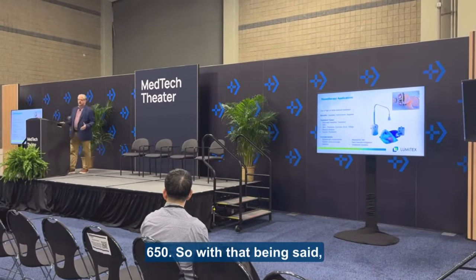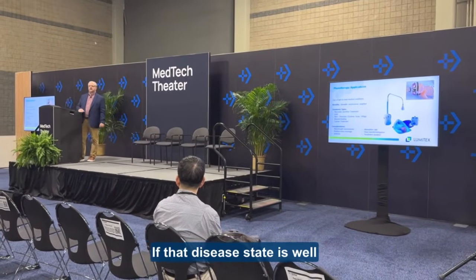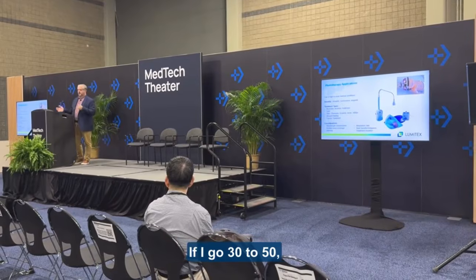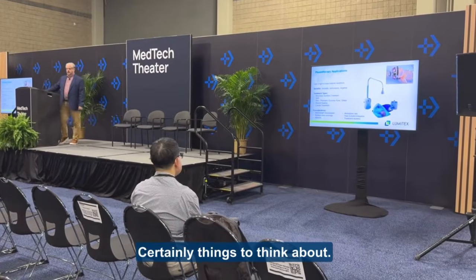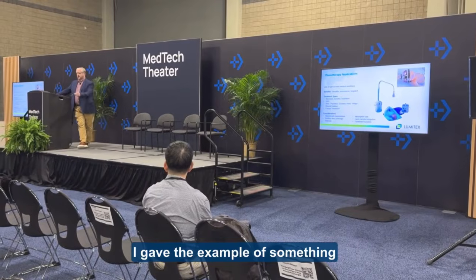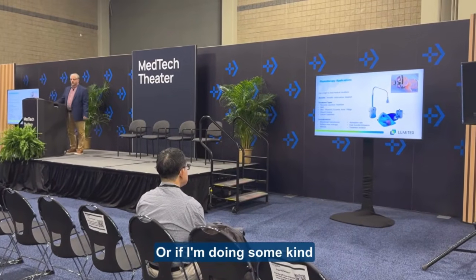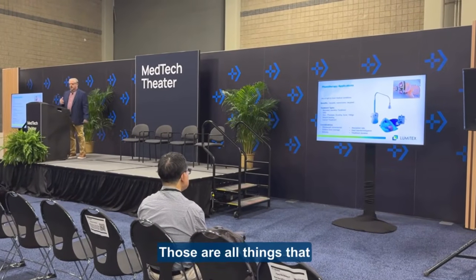So with that being said, what you need to consider is, are there any adverse effects? If that disease state is well treated within that narrow wavelength, what are the ramifications if I go plus or minus that? 30 to 50, are there any adverse effects? Do I have to have the treatment go longer? Certainly things to think about. Surface area coverage is another good one. I gave the example of something like vitiligo. You may need to treat the whole body and put them in some kind of booth, like a tanning booth, or if I'm doing some kind of cancer treatment, I may want to pinpoint exact cells. Those are all things that you need to think about.